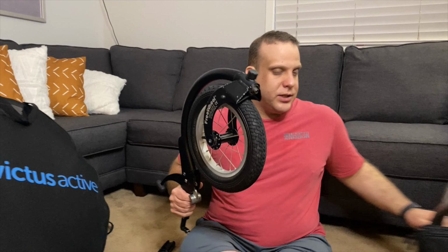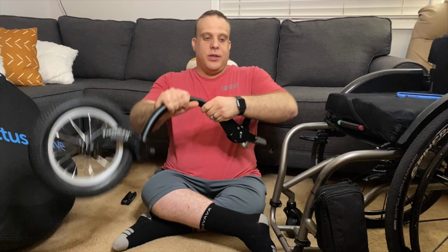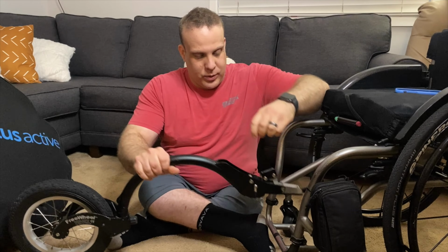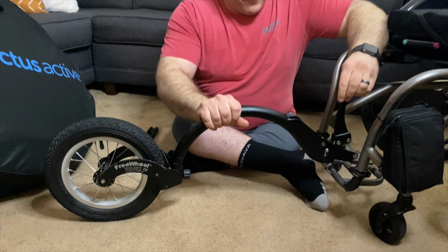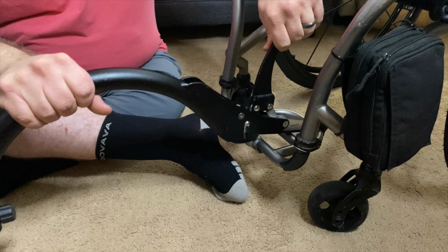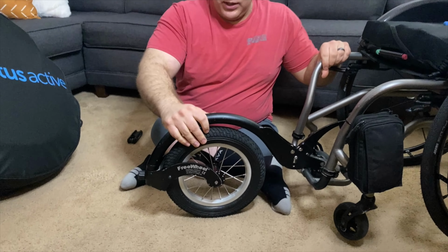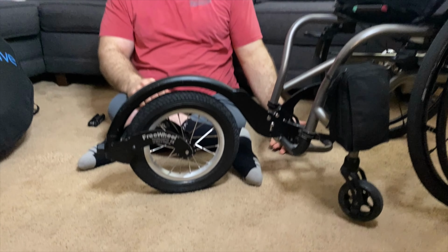So it attaches to the front of my chair, and I can either do this while I'm in the chair or while I'm sitting on the ground like we will today. It attaches to my foot plate really quickly like this, and then we just clamp it down. Then when you swing the front wheel underneath, it brings my front casters up off the ground.